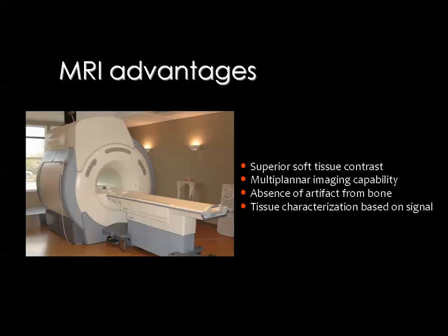This explains the fact that many patients complain a lot about their spine, but whenever they have an MRI in the supine position, you can find little abnormalities or even normal findings. Then you have to scan the patient in the upright position to see the real abnormality.